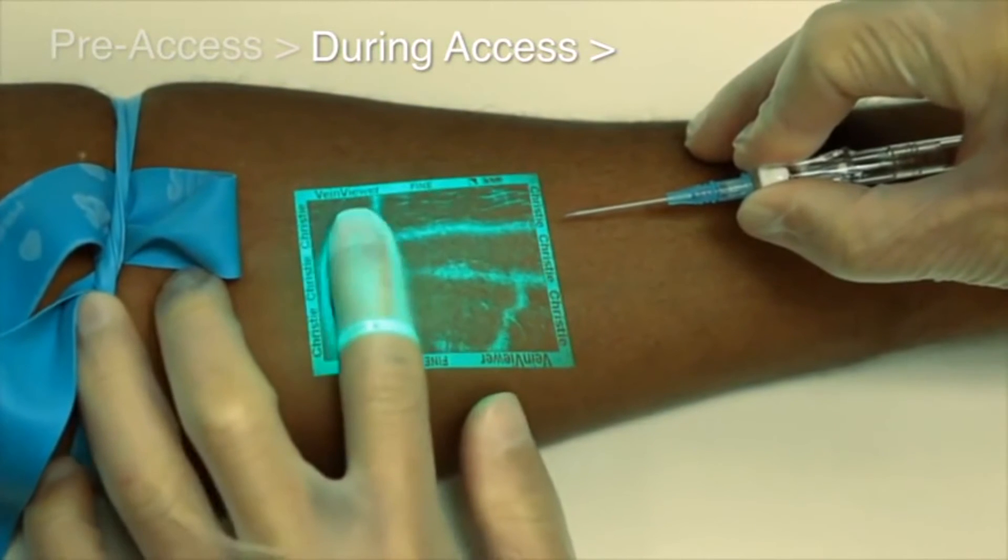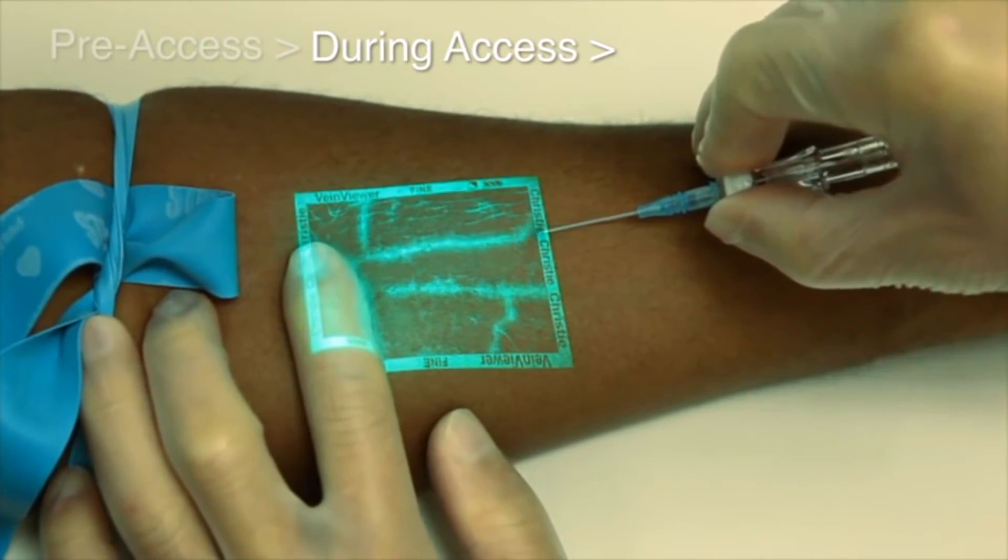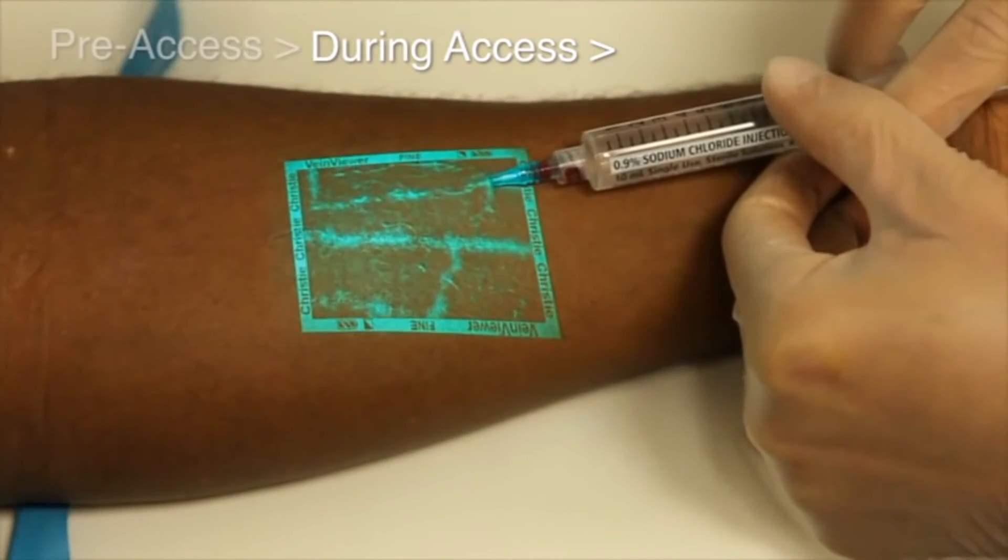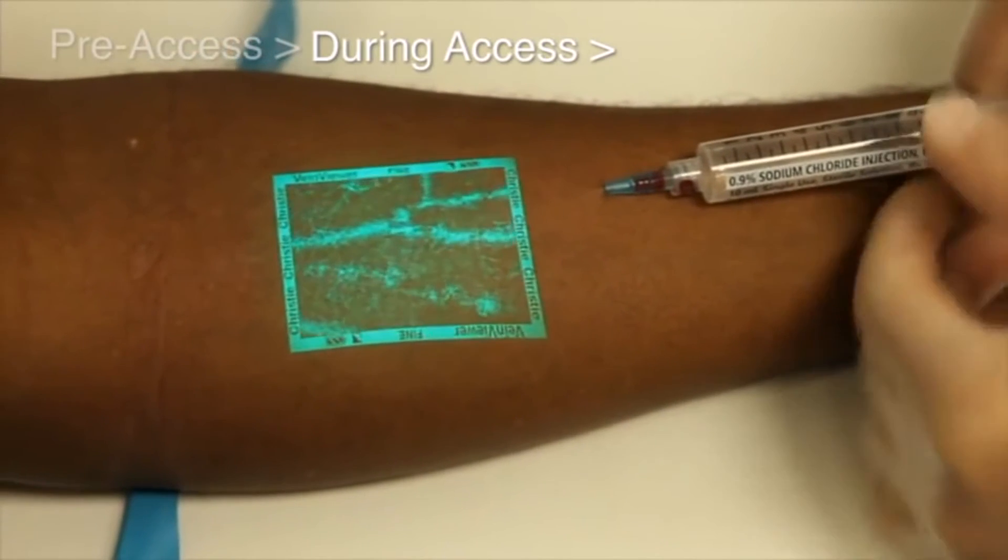VeinViewer can also assist in visualizing the reaction of the vessel during the procedure. See a rolling vein, see fluid flushes to check patency, potentially helping you avoid an infiltration or extravasation.